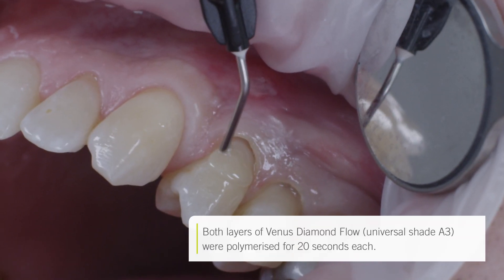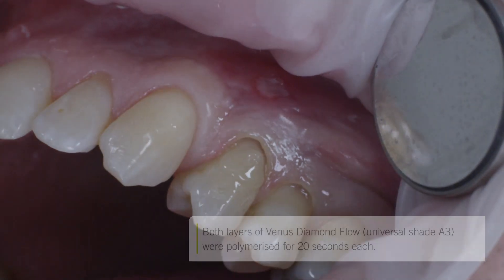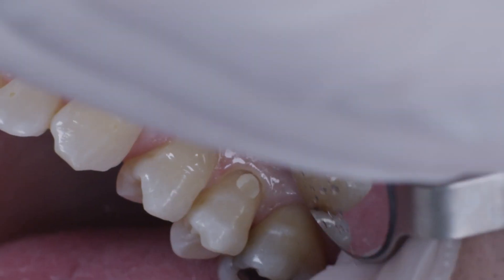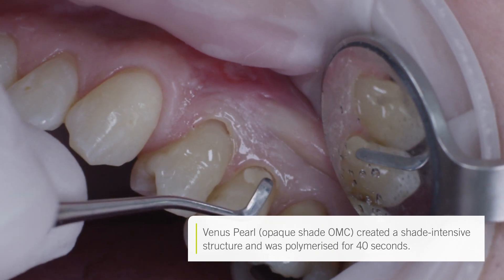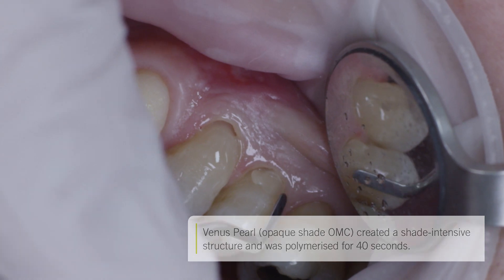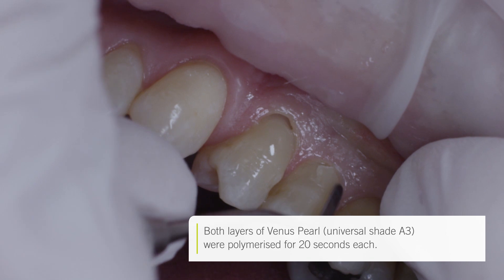For final modeling, I once again used A3 to cover the entire cavity. For tooth 2-5, I used the nano-hybrid composite Venus Pearl. Here, the opaque shade OMC was also placed at the center of the cavity and slowly adapted to the margin. The tooth was built up with two layers of A3 and the filling completed.